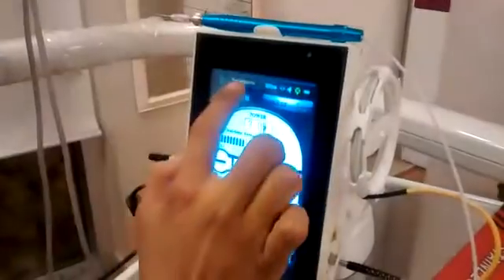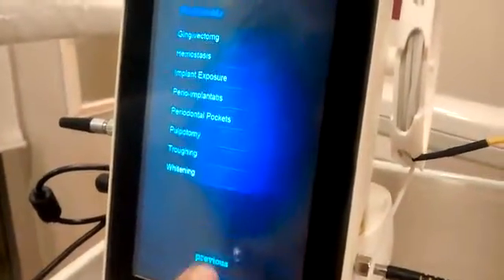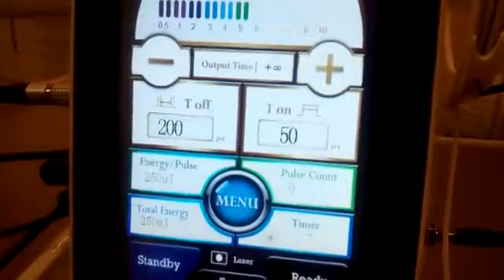This is the control panel and I'm going to check it with the high power first, say for gingivectomy. This is the power setting — it's 5 watt, 200 time off and 50 time on.